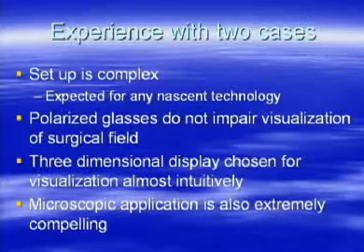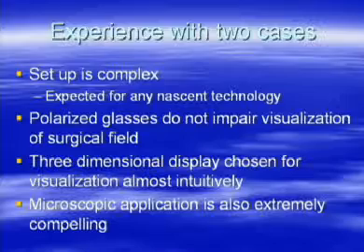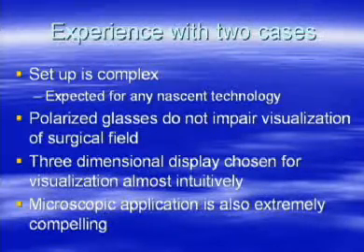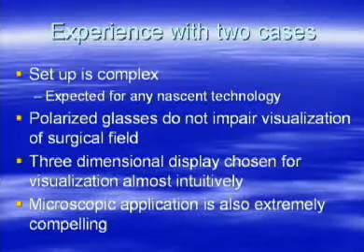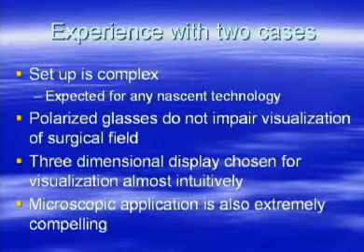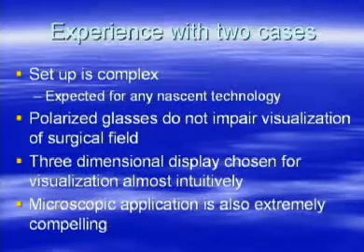However, this is not unexpected for a nascent technology such as what we're dealing with. It was my experience that the polarized glasses that we used throughout the case did not really impair visualization of the surgical field. And the very interesting thing is that we had the Stealth station right next to the 3D location display, the projector system, and everybody who came into the room, including the surgeon and his assistant, were immediately drawn to the three-dimensional display.